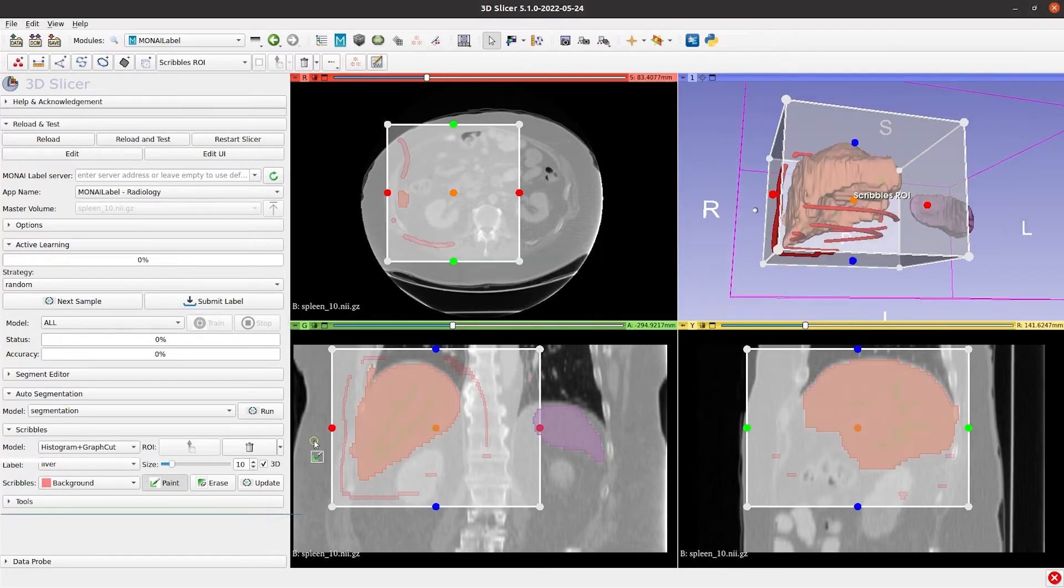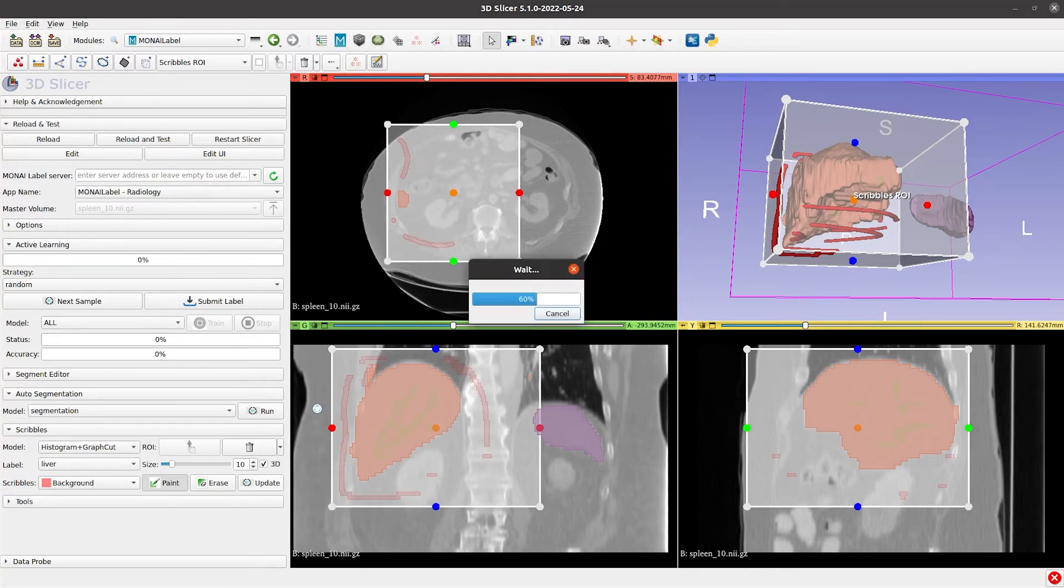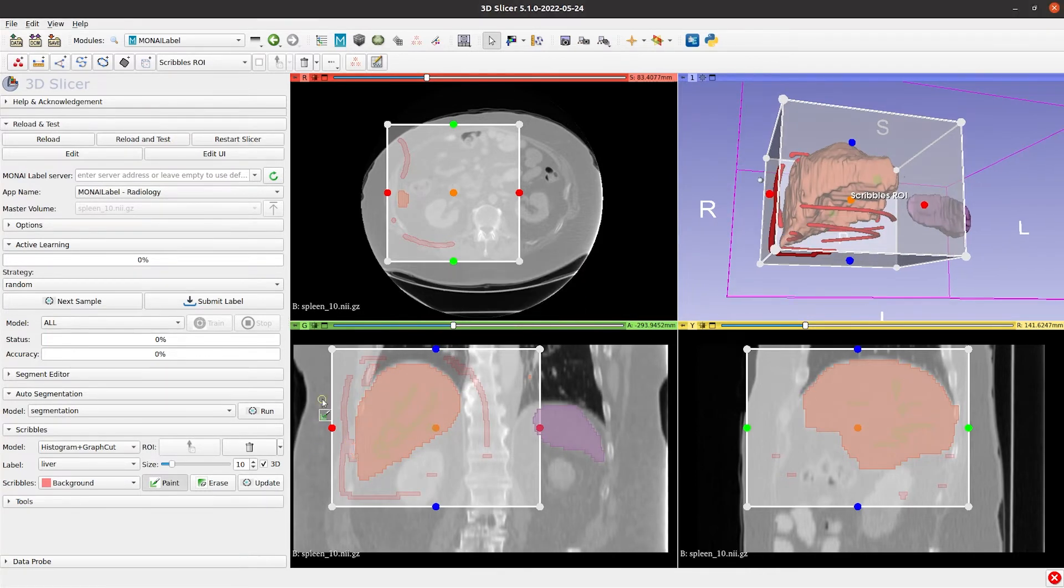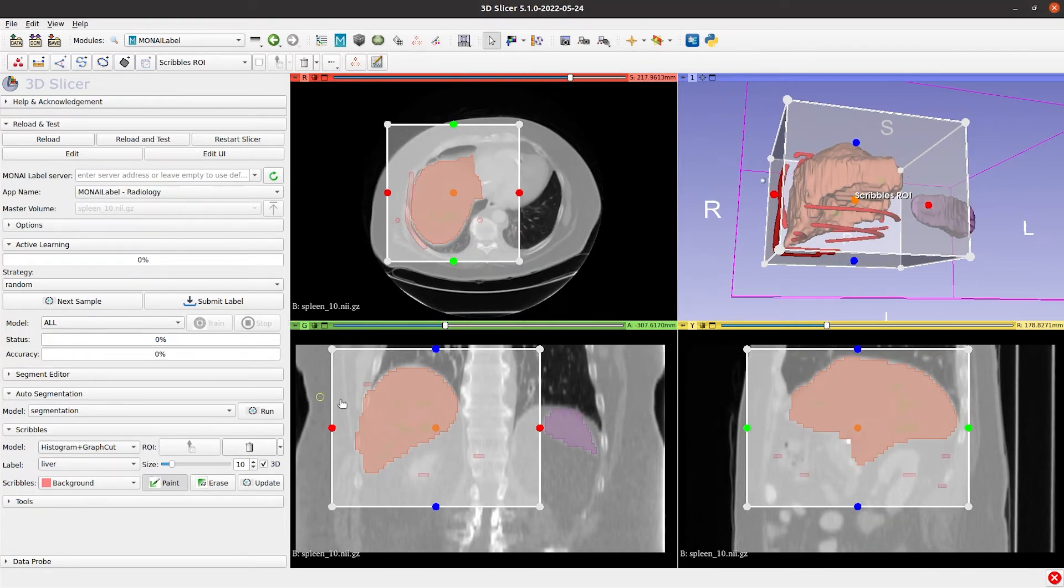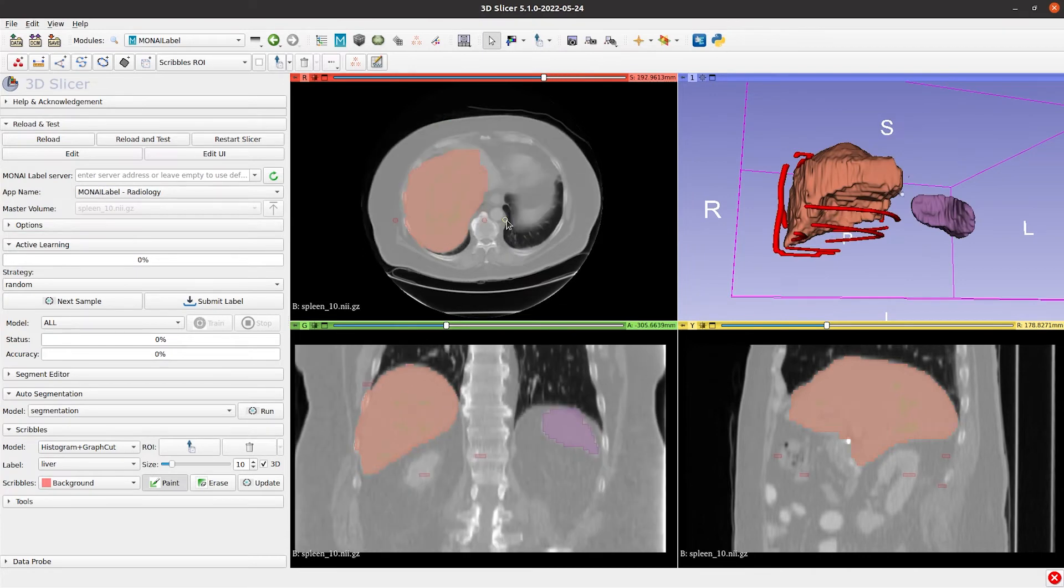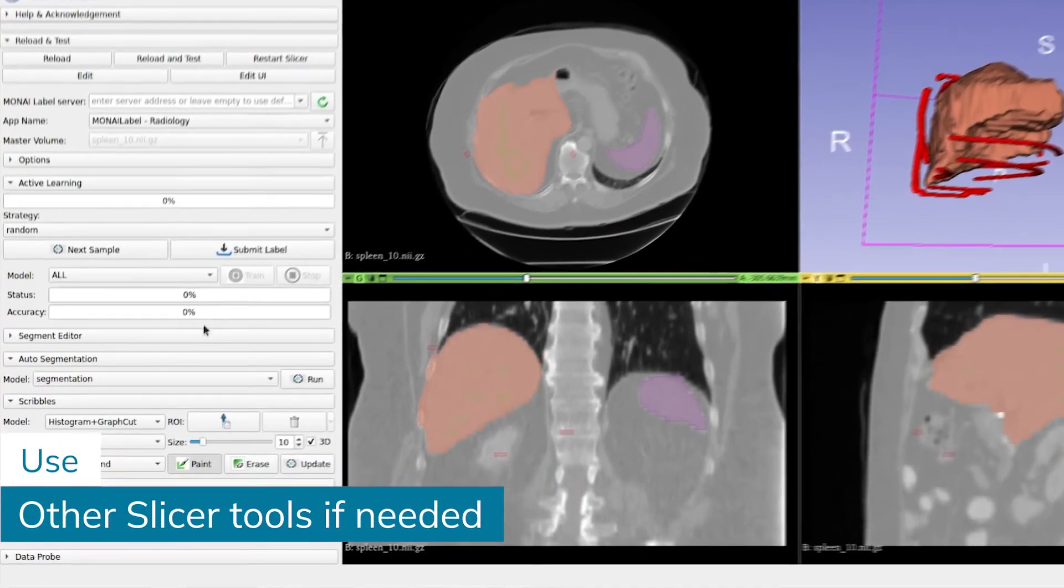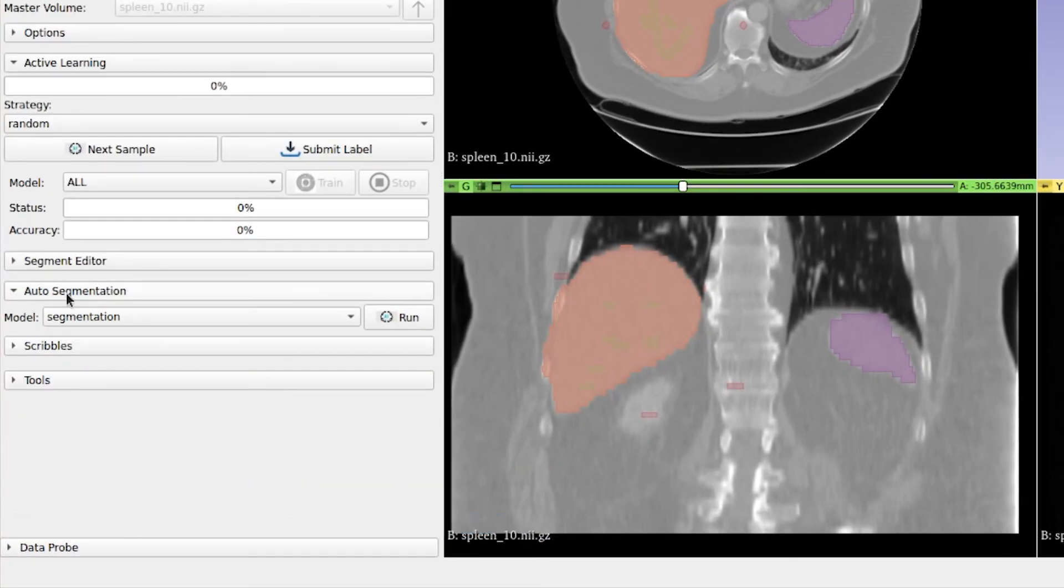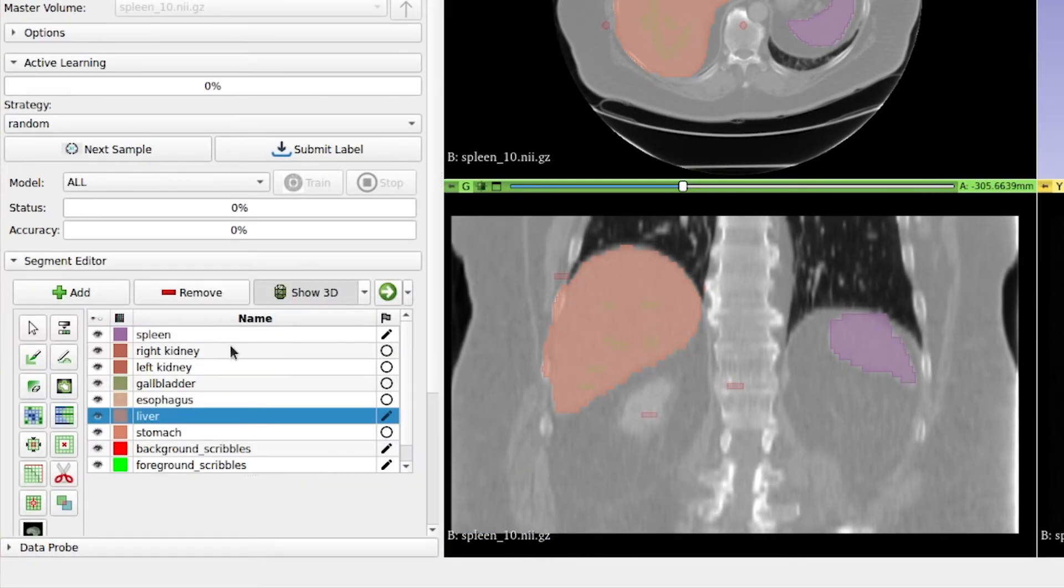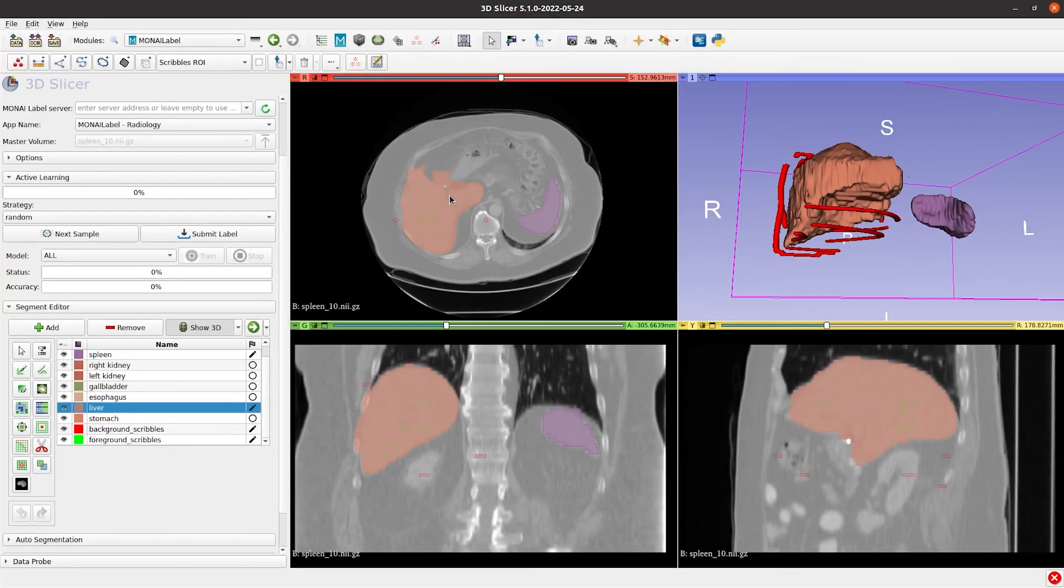You can also refine the label by using more Scribbles and then click on Update. The Scribbles algorithm can be used with other manual tools in Slicer. For instance, the Eraser.